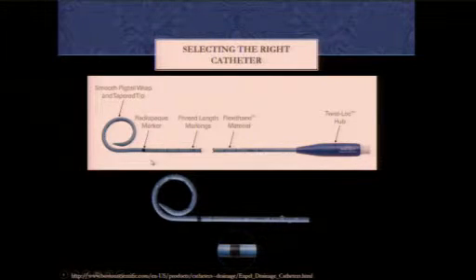They'll have a radiopaque marker so you know where your pigtail is. And they'll have basically this material which you can pass alcohol through if you need to ablate the cyst at the end, and it's rigid enough to keep the material flowing. And some of these will have different mechanisms for locking the pigtail in place.